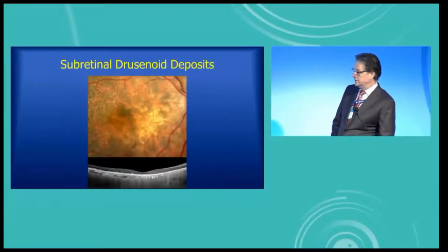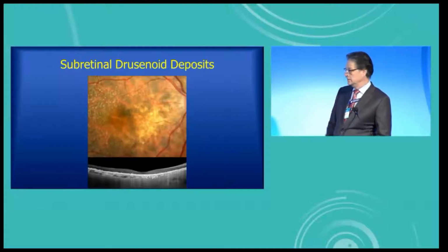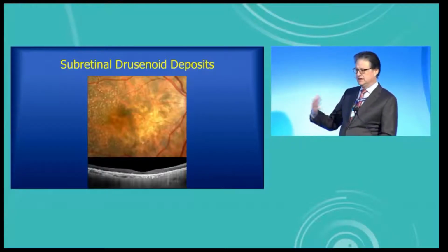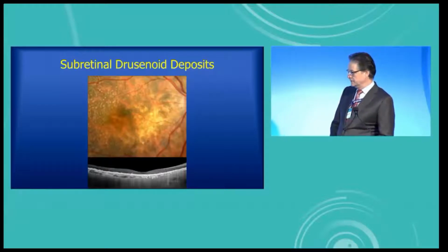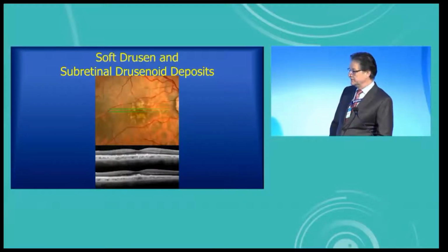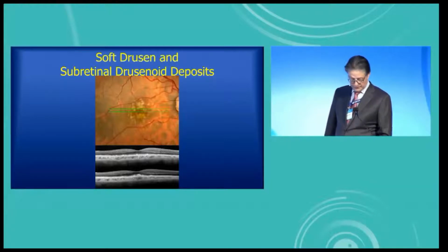These are pseudodrusen, and you can see these pseudodrusen are a little bit whiter than typical drusen. And notice that you see the choroidal markings quite well, and some of the choroidal blood vessels are almost yellow. That's something you see in patients who have very thin choroids. This patient has a relatively thin choroid, as you can see here. You can get combinations. Some patients have soft drusen in the middle and have pseudodrusen where the rods are. And you can see there's an intermediate thickness of choroid.